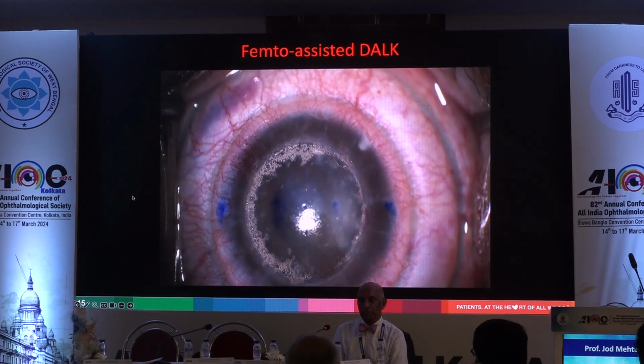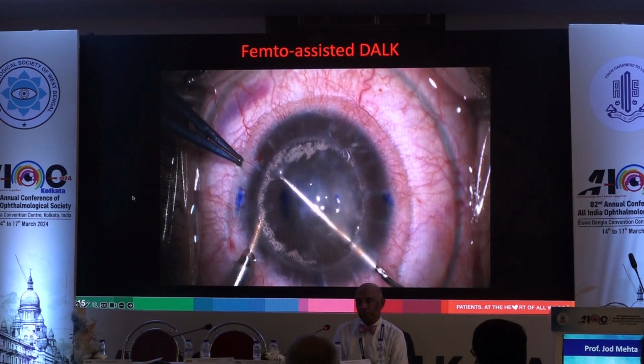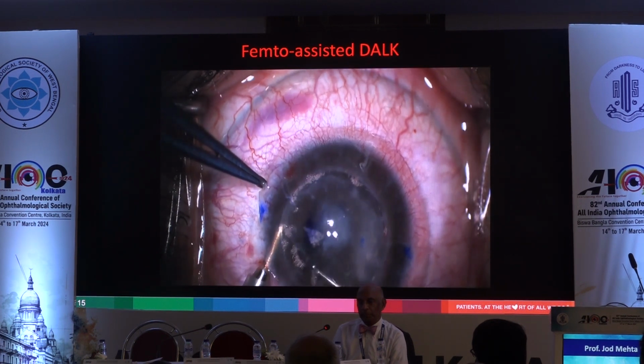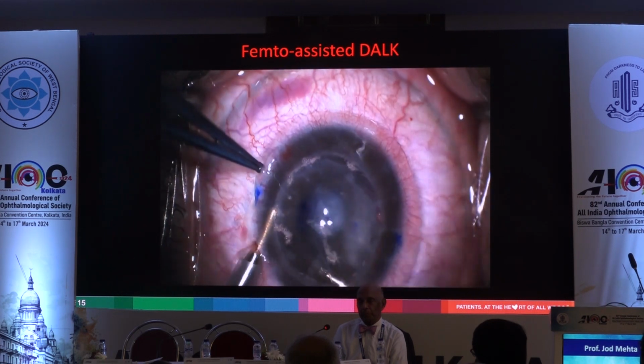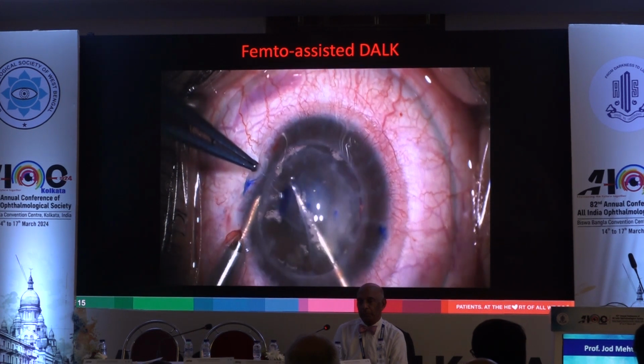So this is the surgery. She's phakic, of course. She's only, I think, 15 now. So went back. Surgery's exactly the same. So again, you peel away the area that's been cut. The bubbles will tell you where the margin of the laser cut is around the surface, and using a reverse Sinskey and a pair of forceps, you can gently peel away the separation.